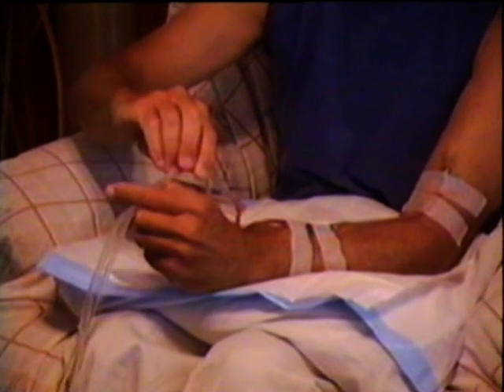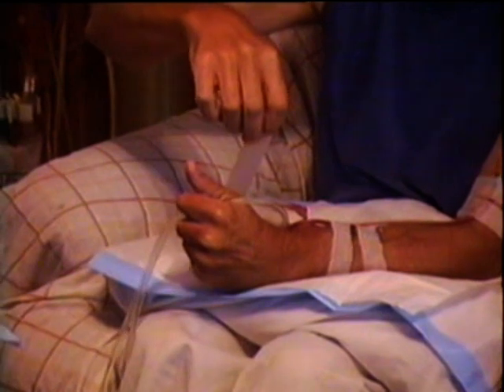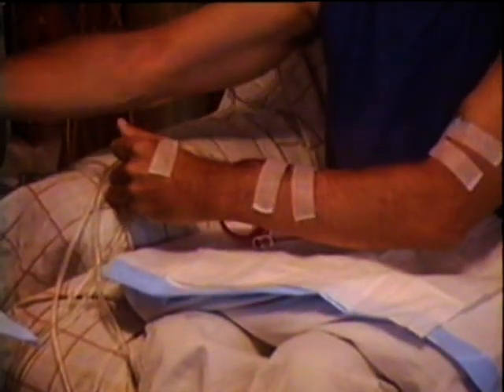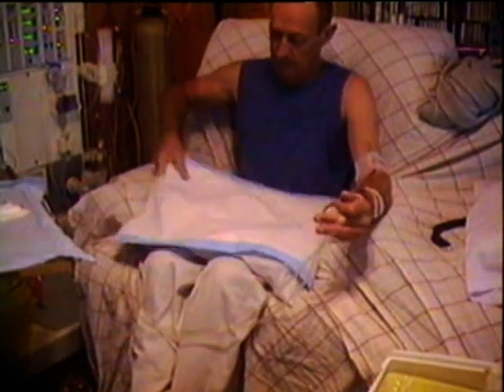Now what I do is just twist that, take these to my arm, because they're going to be sitting there for five hours. Also clamp the lines to the side of my seat. Now that's all clamped, that's comfortable. Throw that away. Now this pillow — which is just a bead pillow — put it here, and I can rest my arm up here. Now that's ready. I'm comfortable.